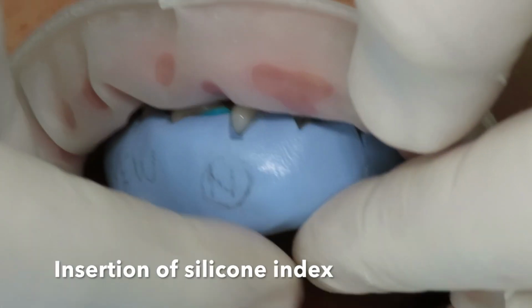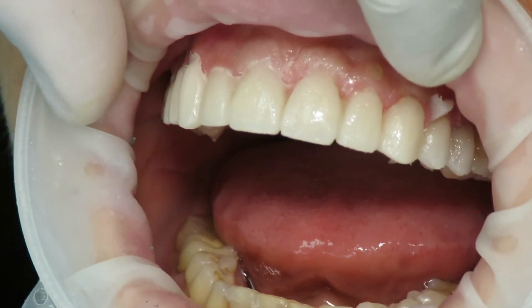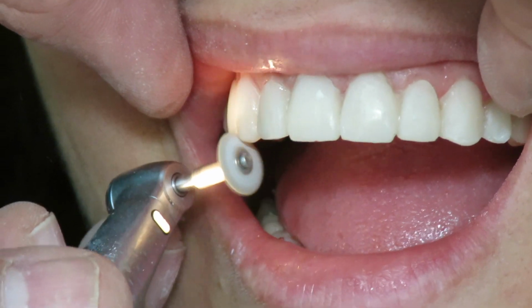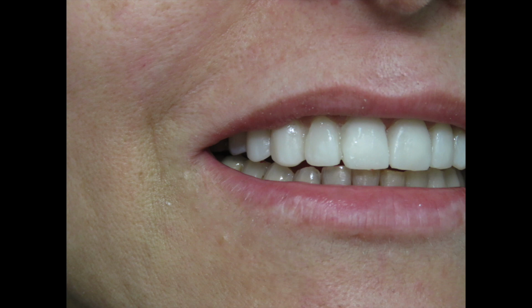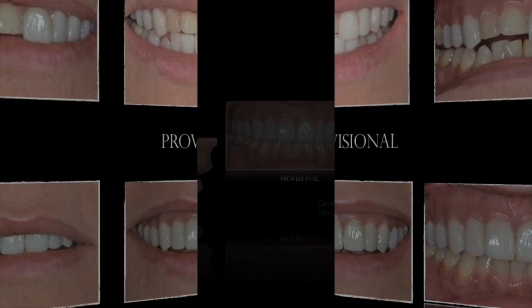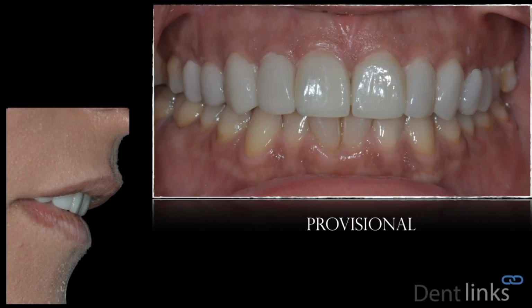So regarding the temporaries, again, our wax-up and our silicone index are always our reference. We used it to finalize. These are the temporaries that were placed, with some adjustment, of course, in situ, clinically, intraorally, and the patient was very happy, and you can see the result, how we started and how we ended with the temporary. This is the provisional after final placement. It's always important to see the reaction of the patient to the temporaries, as that will guide us to the final restorations.